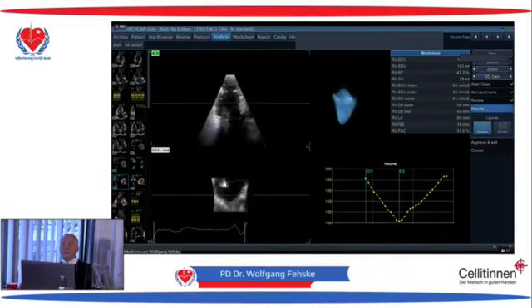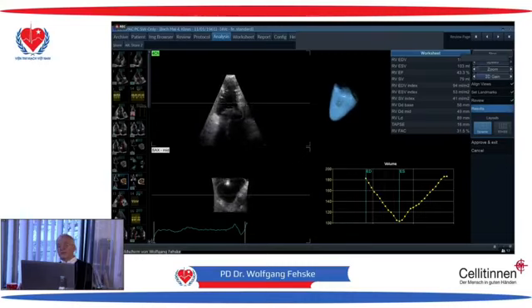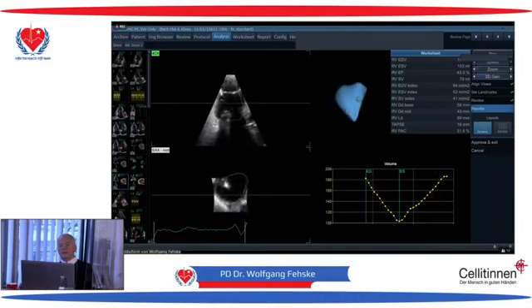You see the septum, this is the tricuspid valve, this is the pulmonary artery, and then what is really impressive, most of this diagnosis, is that the interventricular septum is pumping for the right ventricle. This is complete paradoxical movement of the interventricular septum. And the other thing is also true, that all this area is not moving at all.